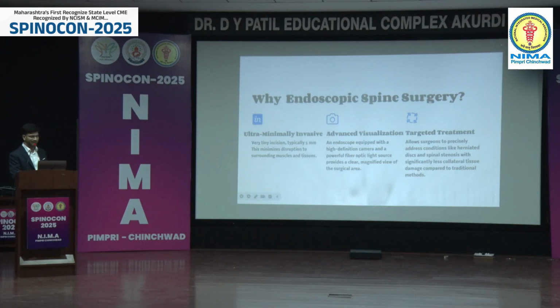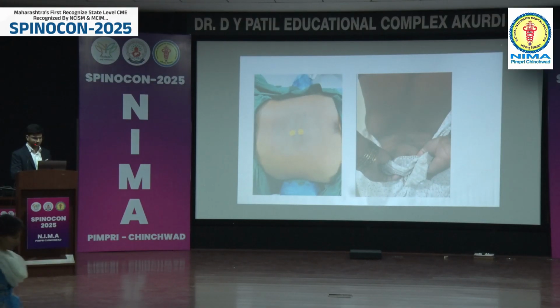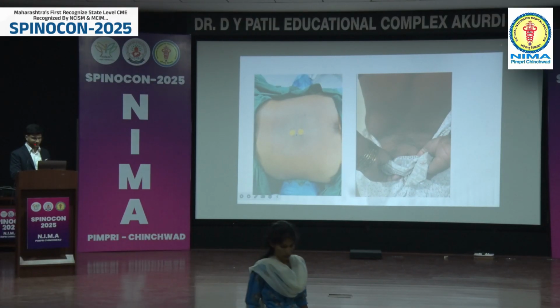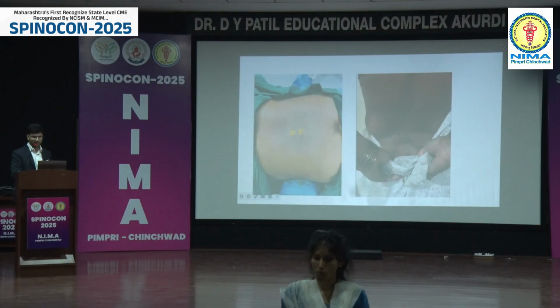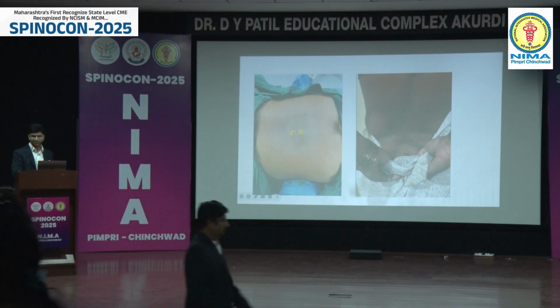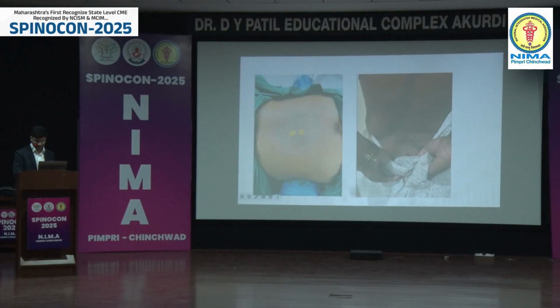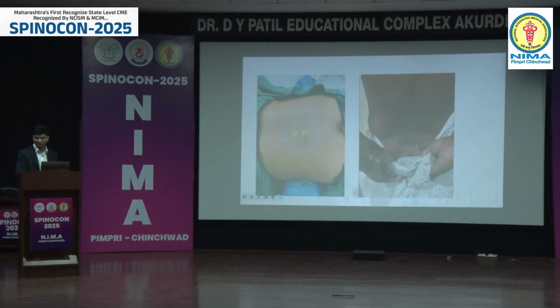We'll start with the ultra minimally invasive. What do I mean by that? So this is ultra minimally invasive surgery. The entire surgery is performed using just 2 5 mm cuts. And this is the post-operative dressing using just 2 band-aids, that's it. This is another patient, 1 month post-surgery. Even I had difficulty in finding out where the scar is. So this arrow here is a surgical scar, barely visible.